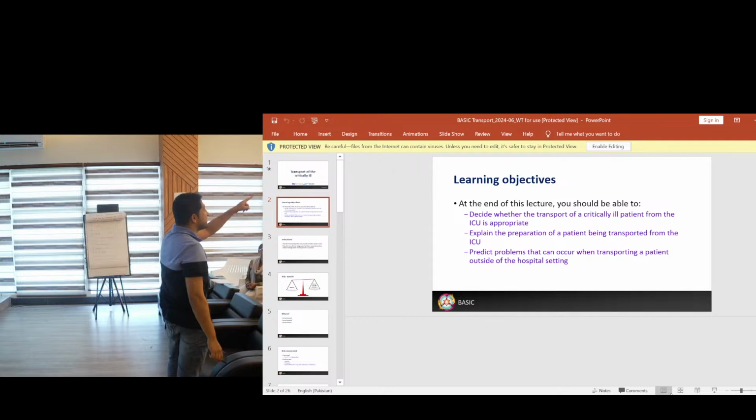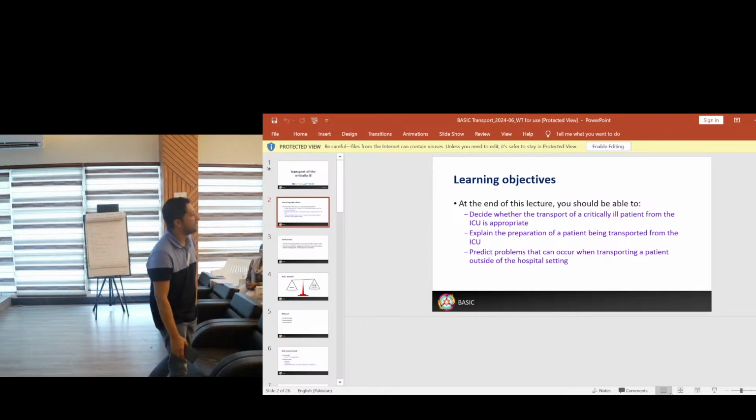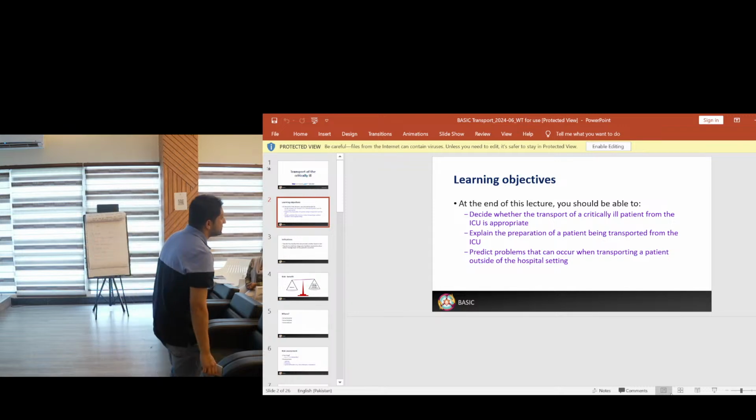So yeah, if you have a PEEP valve, you should use it. I mean, I don't know, there is a Waters Mapleson circuit that I saw yesterday on the table. But if you don't have a Mapleson circuit, do you just use an ambu bag? Yes. Okay. So if you have an ambu bag, even ambu bags do occasionally have PEEP valves, but if you don't have a PEEP valve, well then you have to just go without PEEP. Yeah. Basically. How would you be able to run? You can't. Oh, well, true.